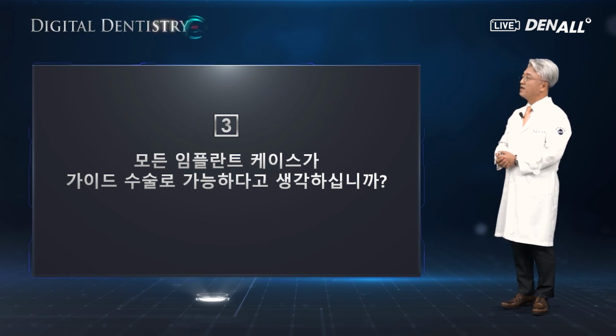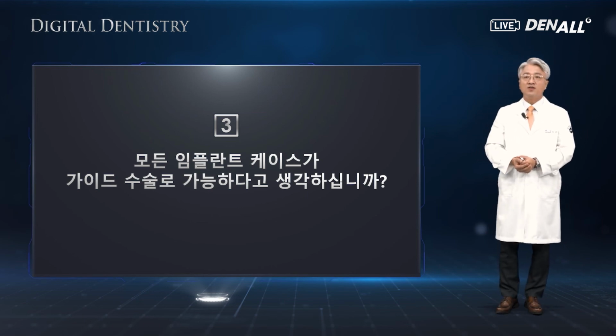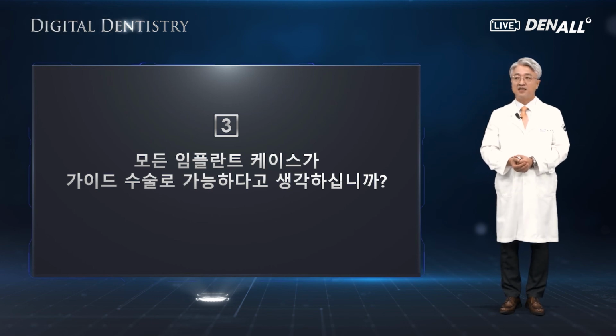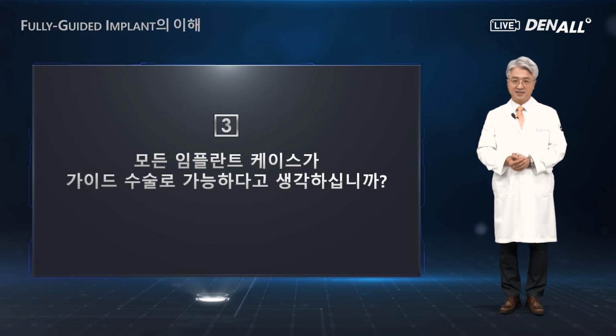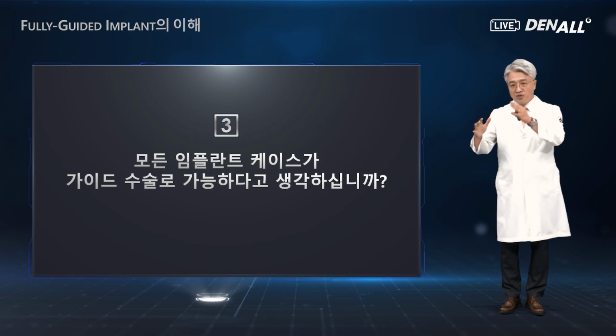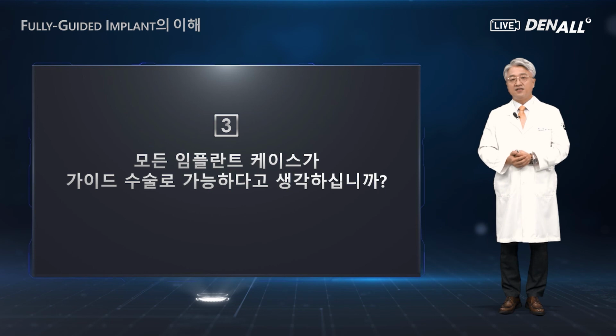The third question, can guided surgery be used for all implant cases? Just to say yes or no, that can be controversial, but based on my clinical cases, I showed you the soft tissue management case, also sinus lifting design. Soft tissue can be designed as well.